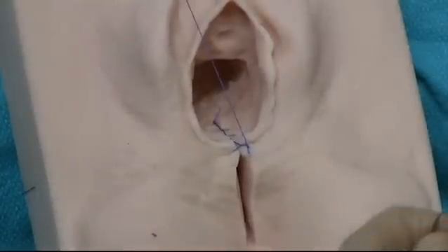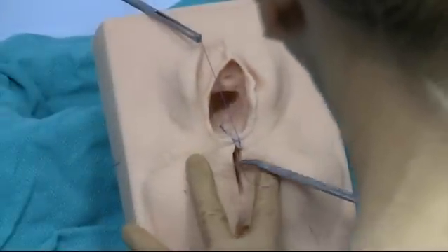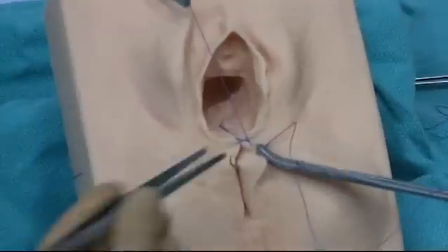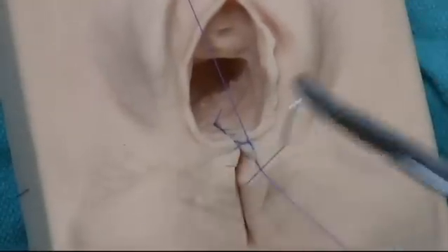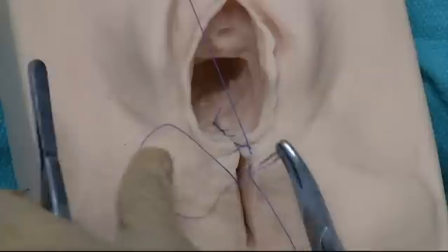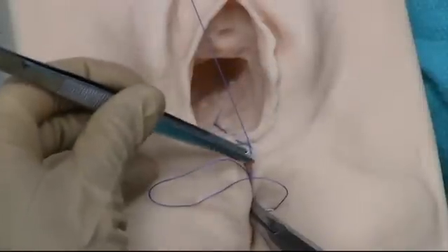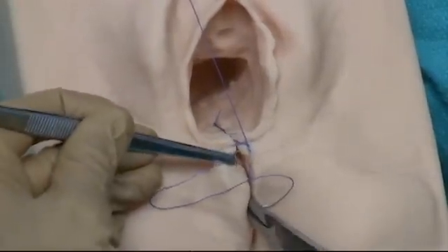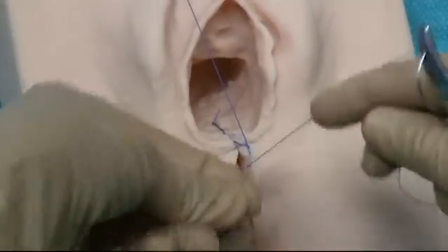Now I'm going to do a separate stitch for the bulbocavernosus muscle. That's a nice deep stitch — it's more like a V-shape. On the left side of the woman's body you're starting at the top and going down into the middle, and on her right side you start in the middle and come up to the top. That's going to bring the bulbocavernosus muscle together — think of that as now we're working on the second side of the triangle, the deep part. And once again tying off with three knots.